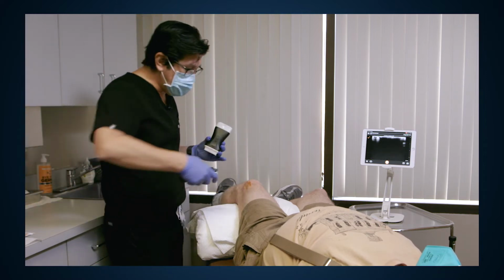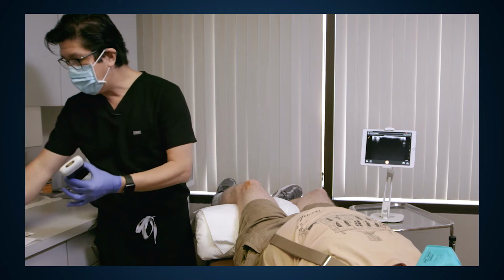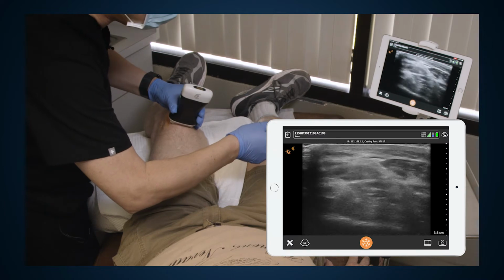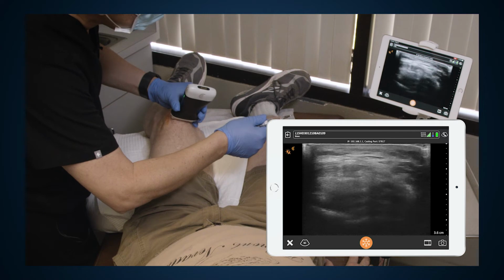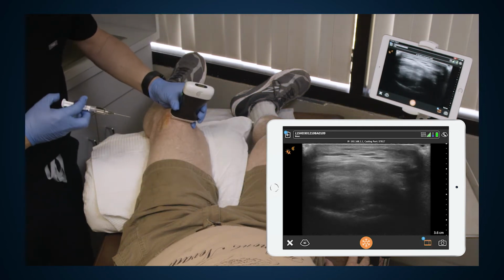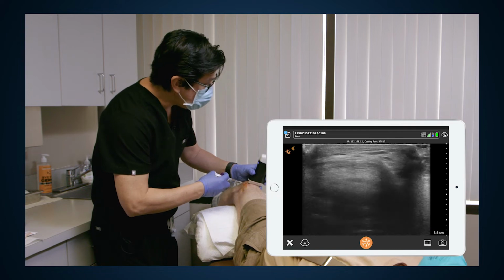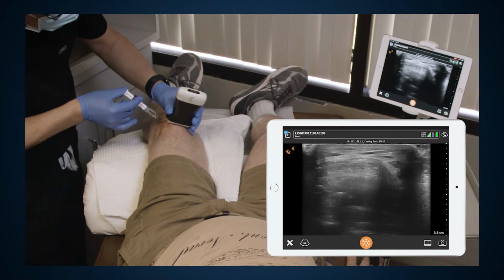Okay, I'm going to numb it up. Prepare for the injection. We're going to put this on, make sure we're in the right spot. We're happy with our positioning. There's a good spot. Take a picture for recording the video and then entry. There in the right spot. Yep, in the right spot. There we go.